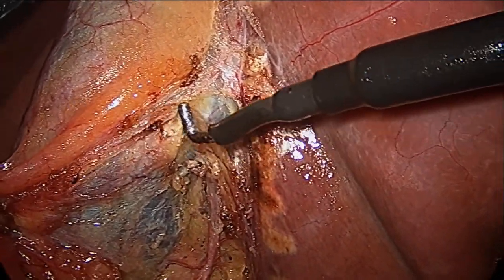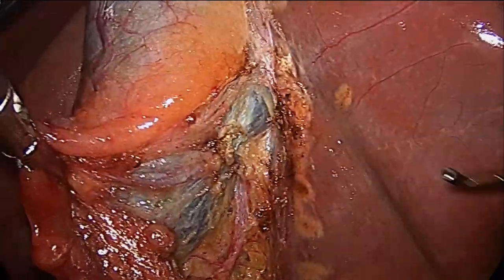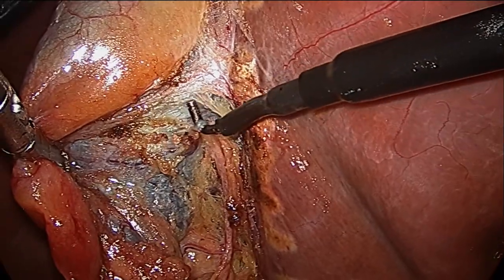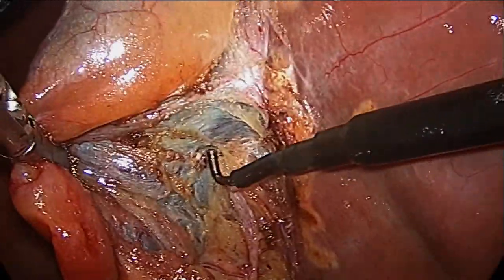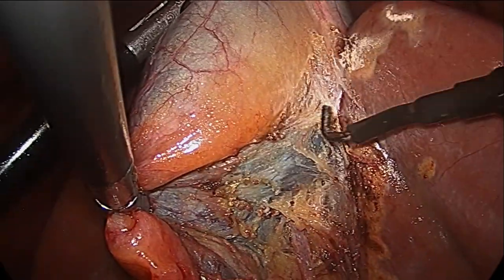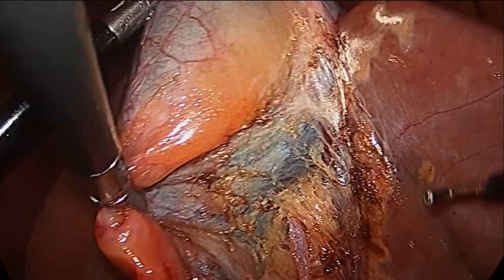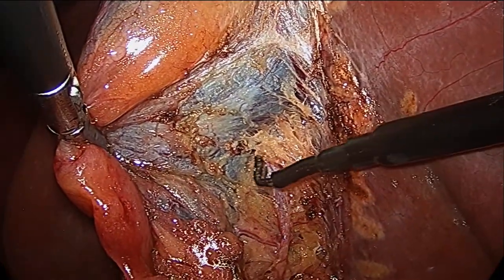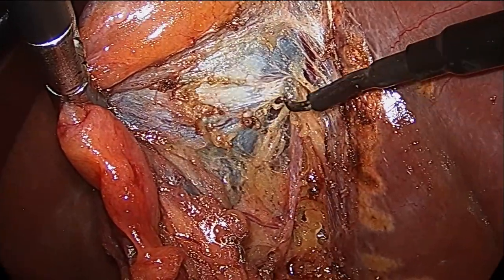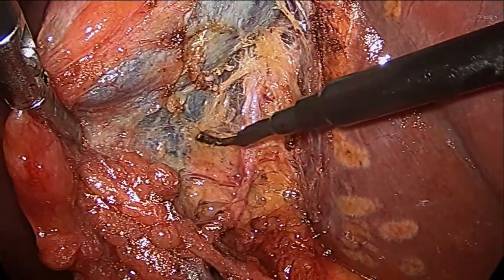Thus, I simultaneously carry out the mobilization of the gallbladder from the liver. Again, in my opinion the hook is most ergonomic. I also use relatively low coagulation rates — no more than 15 watts.